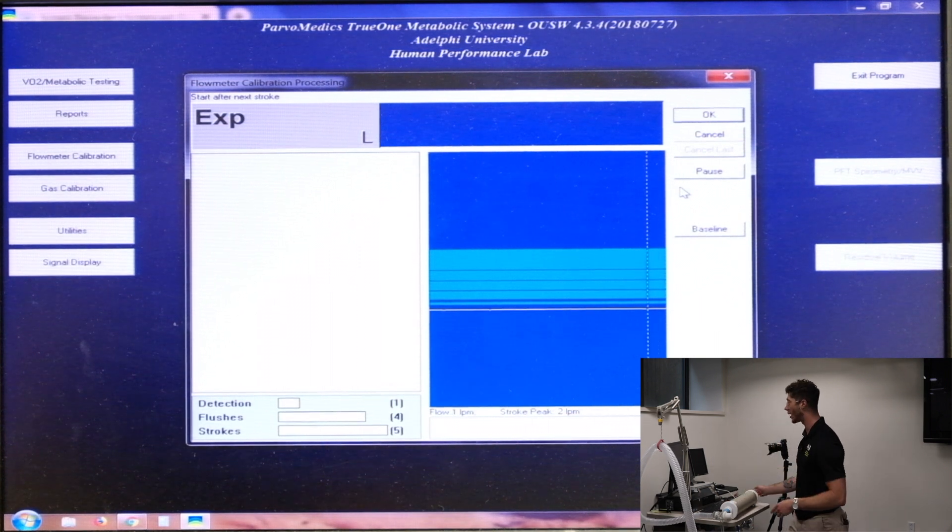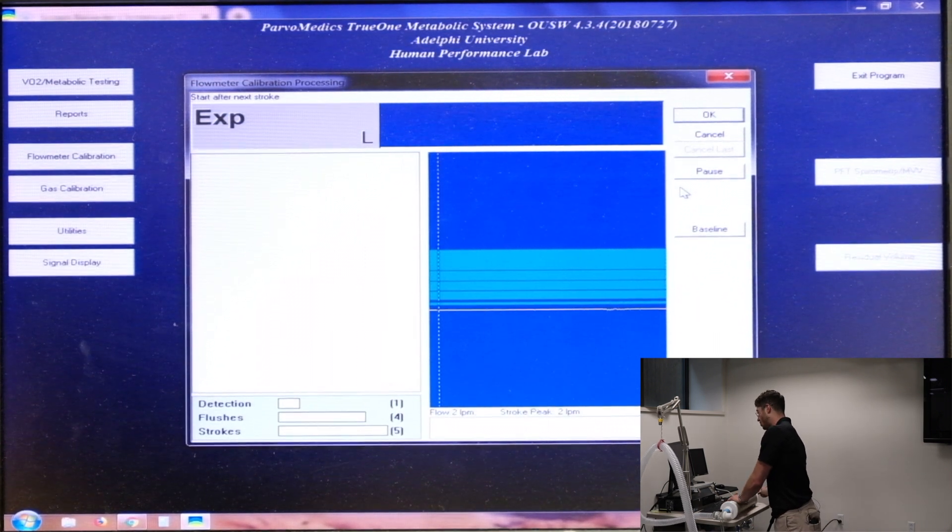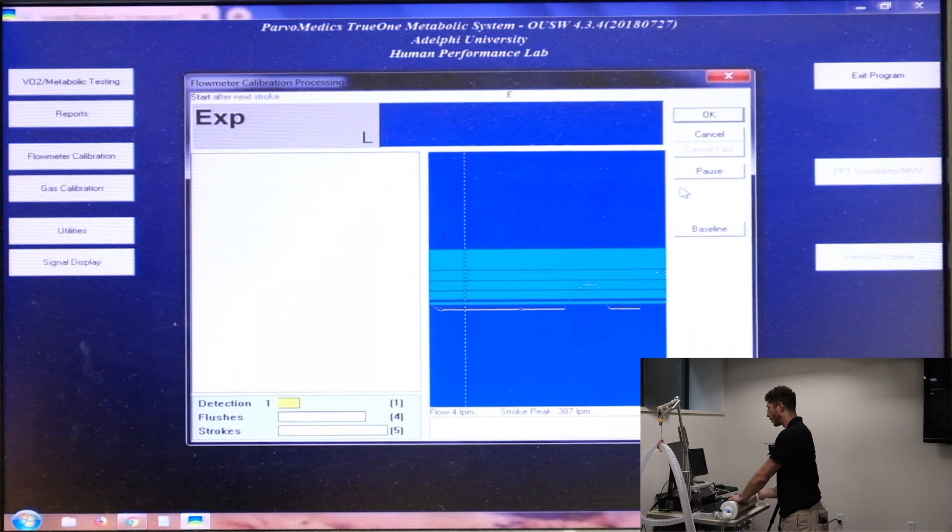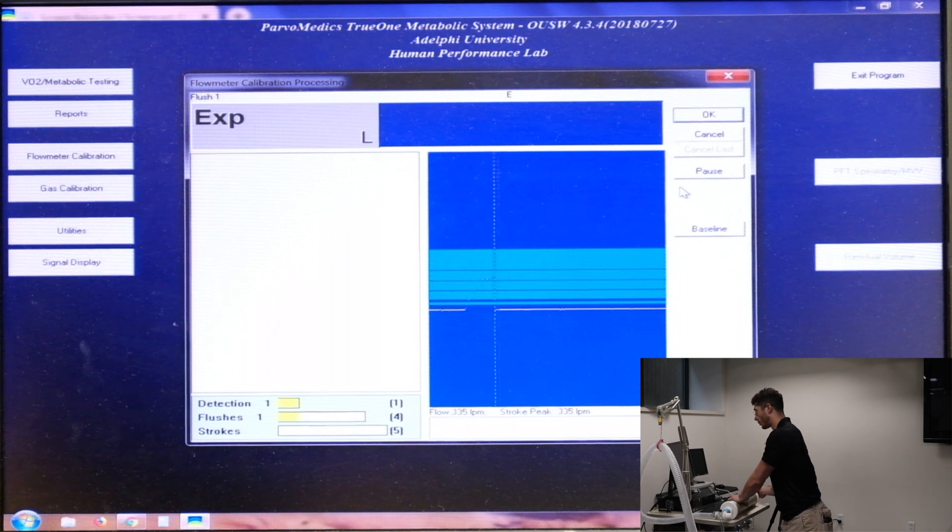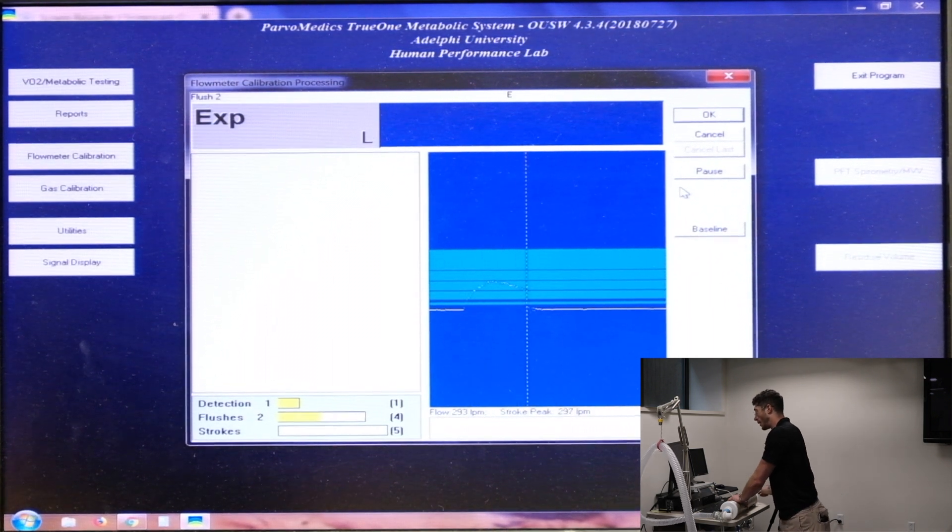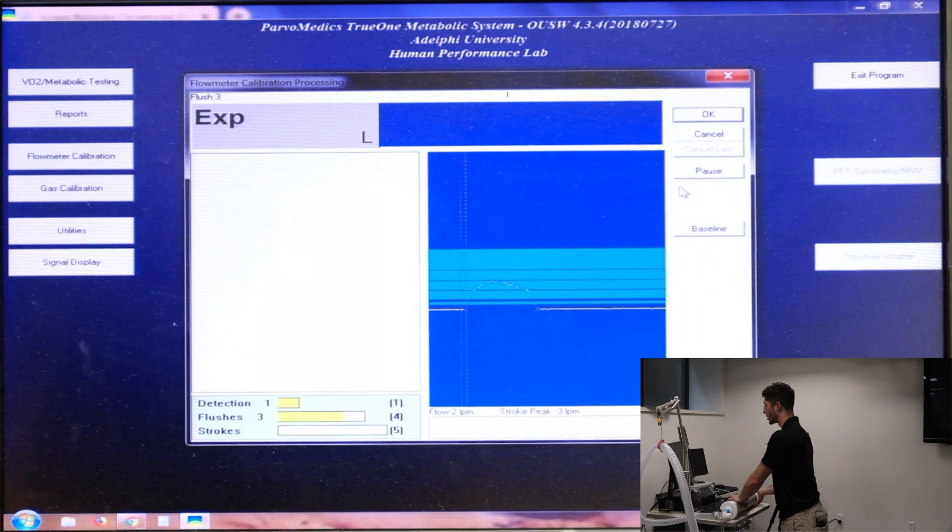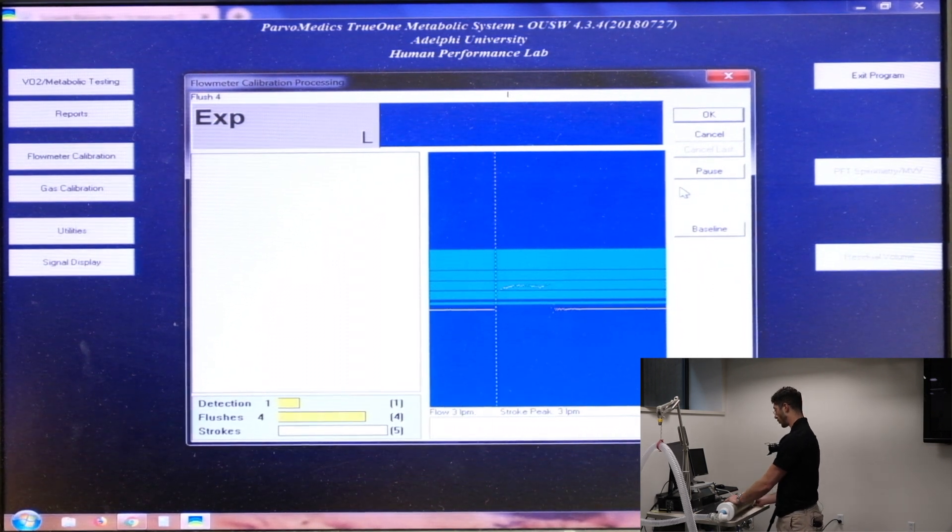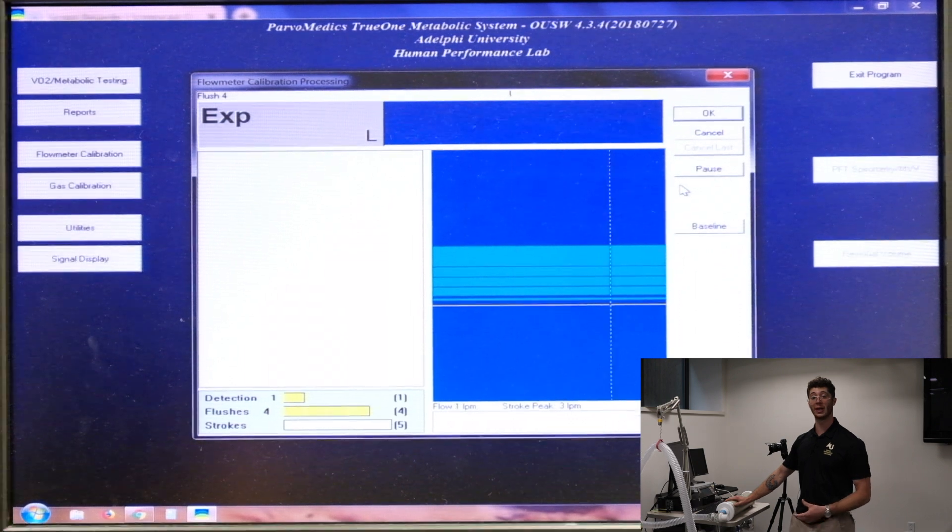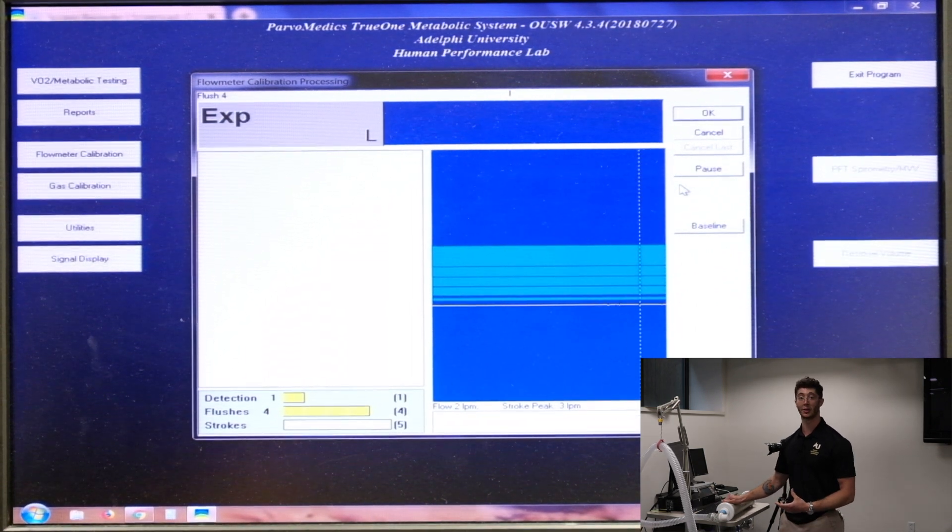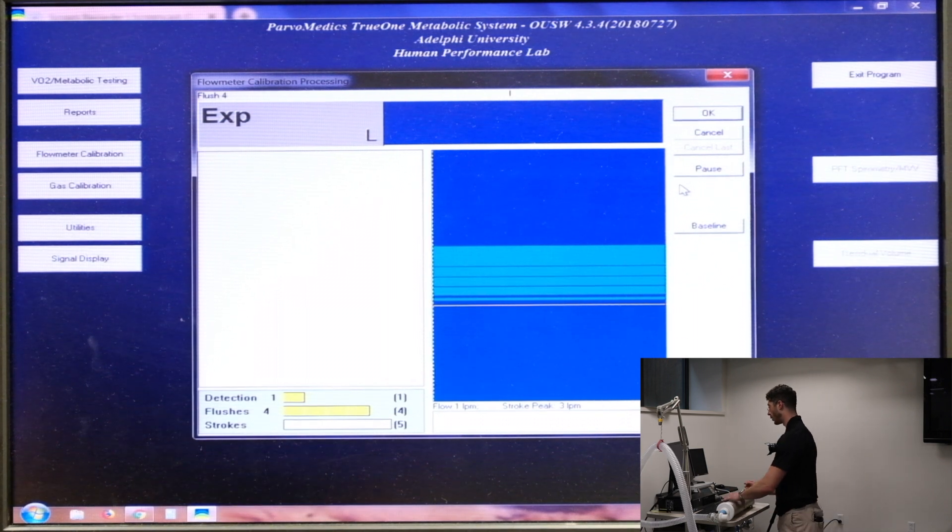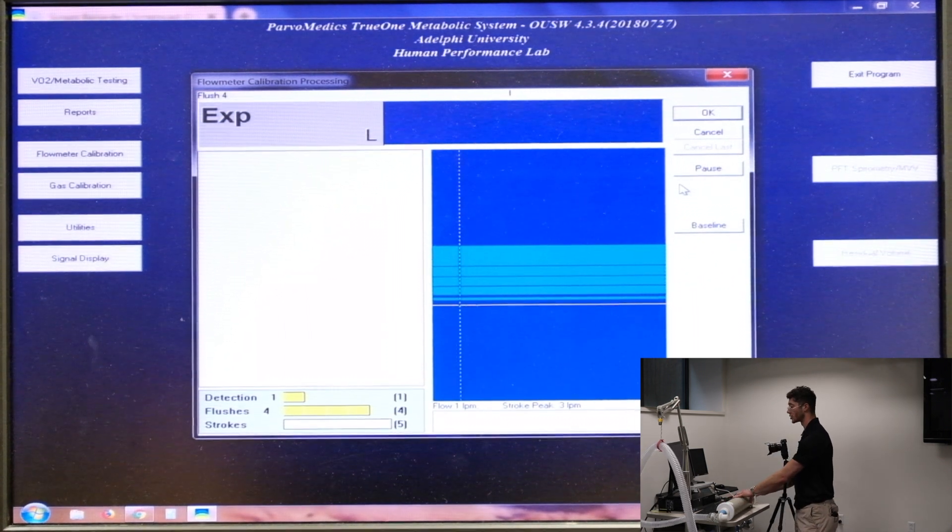So we can get started now. The detection flush. This is just one full flush. And the purge flushes are also done now. So make sure that you pull the plunger out entirely and you depress it entirely. That way you're getting the full three liters of air going through the system. Now we can start our actual strokes.